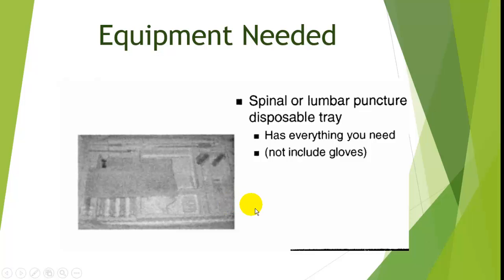So that's why we do it. Those are the potential events that could happen if we do it. Now, how do we do it? Well, it's a good idea to start with a lumbar puncture tray, since it's all been prepared for you.